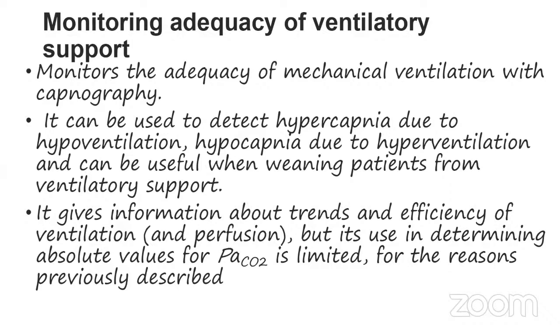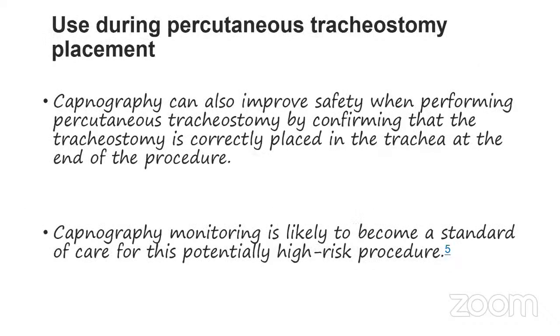But at the same time, we have to monitor the PaCO2 sometimes. It is also used during percutaneous tracheostomy. It helps to improve safety when performing the procedure and confirms that the tracheostomy is correctly placed at the end of the procedure. Capnography monitoring is likely to become the standard of care for this potentially high-risk procedure, most of the times when we struggle during the procedure.